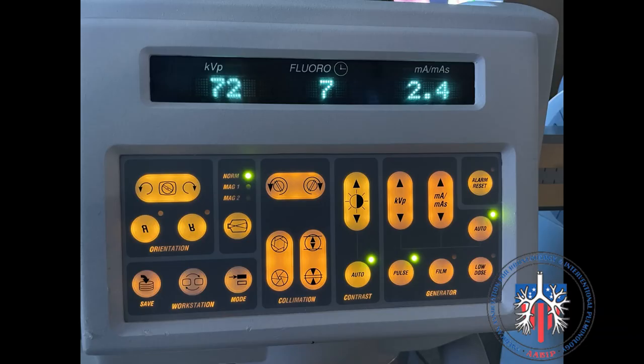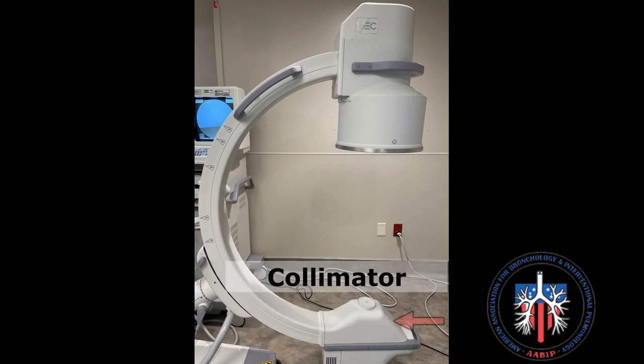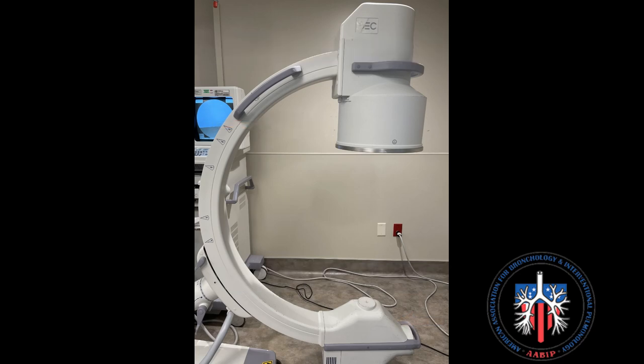Ensure that the orientation of the image is correct by selecting or deselecting the R buttons shown here. The X-ray tube is located here, with the collimator located above the tube. The image intensifier is here. The beam projects from the tube to the image intensifier and the images are sent back to the monitor.